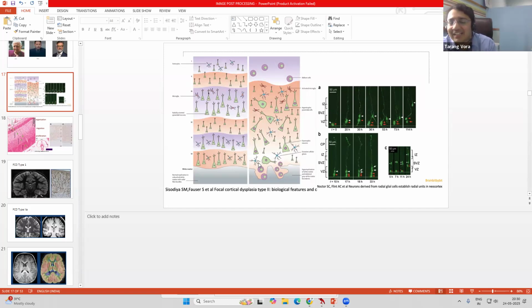Sometimes the seizures can be very subtle and cannot be made out clinically without any EEG. Yes, I highly recommend it. May I ask, do you do EEG at your center during the PET? Yes, we do it.